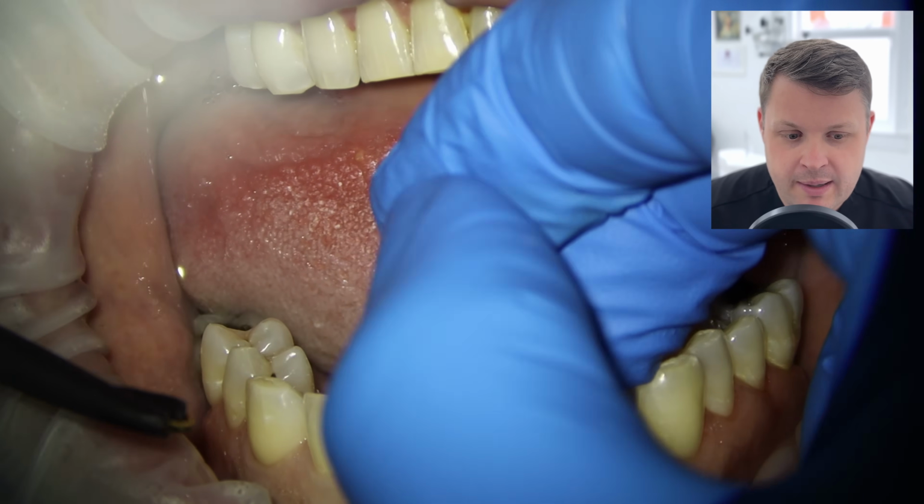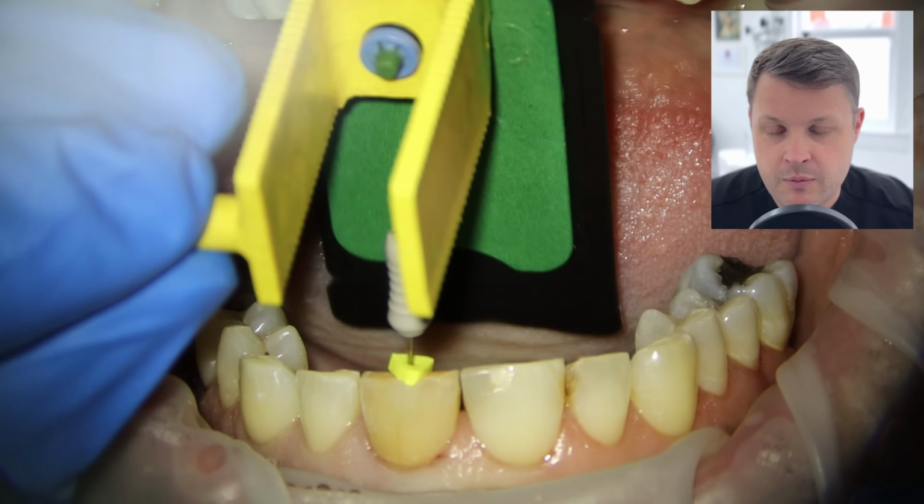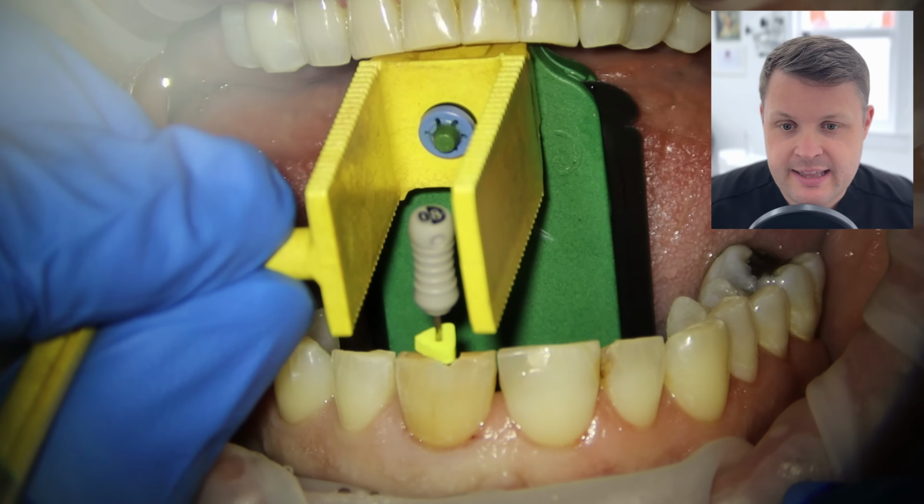So what I'm going to do is take a working length X-ray with the hand file in place, and at this point I feel like I am straight down the middle of the tooth. It looks like it's going along the path of where the root might be, and I am quite happy that I have managed to find a canal space. So I'm giving myself a pat on the back, and I'm saying, well done, Sam. I'm telling the patient I'm amazing, etc., etc., etc.